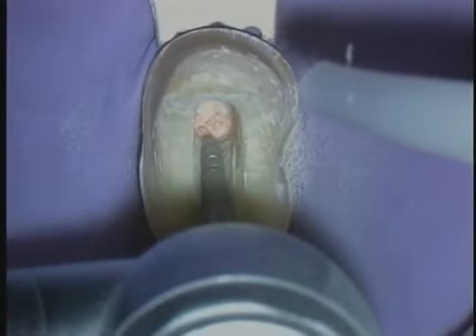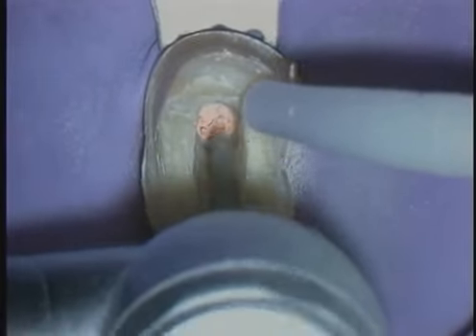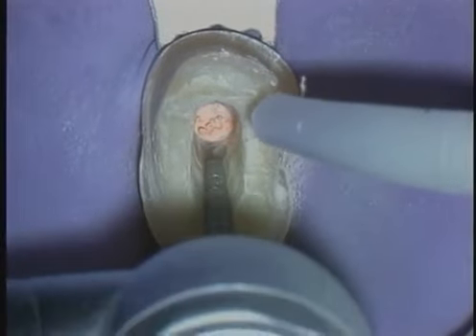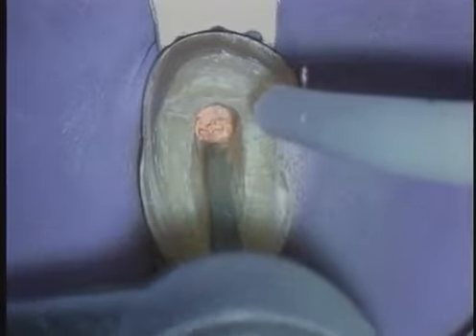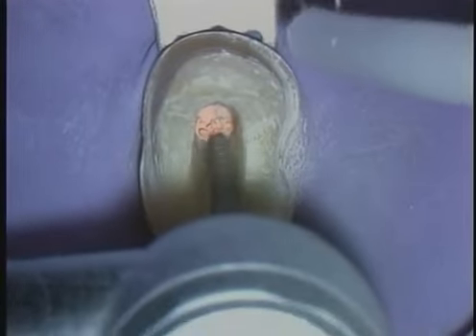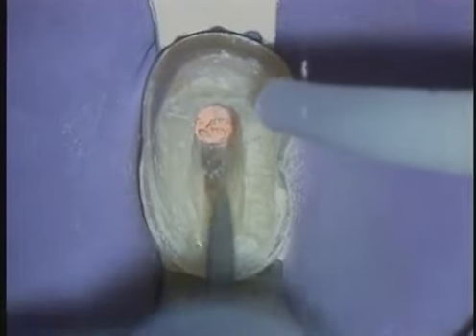Surgical length diamonds true up axial walls, and flat axial walls refract light better to the observer. This means our vision's enhanced. With that wall trued up, you can begin to see a little bit of indication of some material or the suggestion of a second orifice. Notice how we carry that wall to the lingual. We can begin to see that it makes sense that that orifice would be there because it's about evenly centered between the lingual wall and the orifice containing gutta percha.